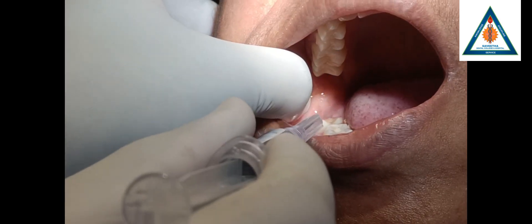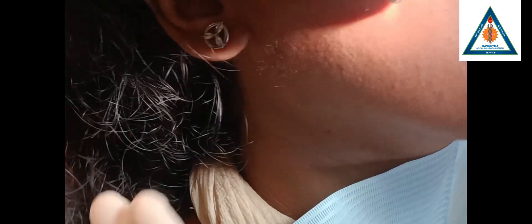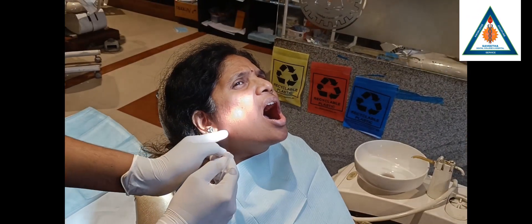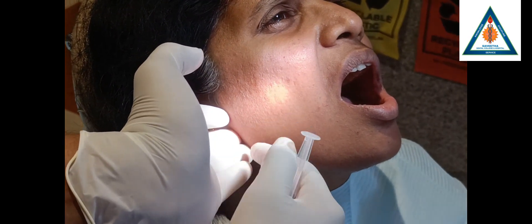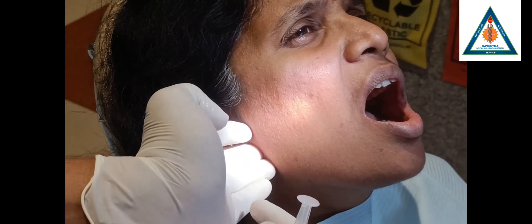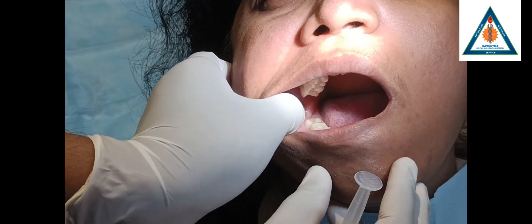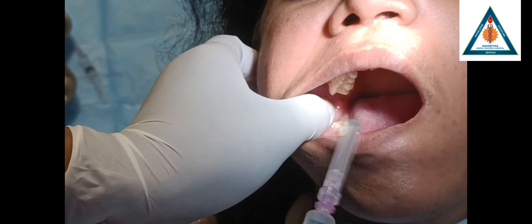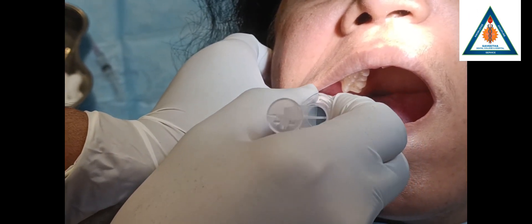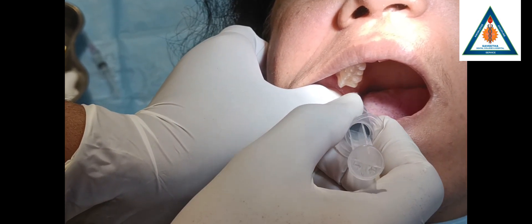The three parameters are: height, anterior-posterior positioning of the needle, and depth of the needle insertion. This will be forming your ramus region — this is the posterior border of the ramus. All your index finger, middle finger, and all fingers have to be supporting the posterior border of the mandible. Then palpate the coronoid notch over here, and make the tissue retract to this side. After you palpate this region, an imaginary line over the thumb region has to be marked, which will guide you in attaining the height of the needle.